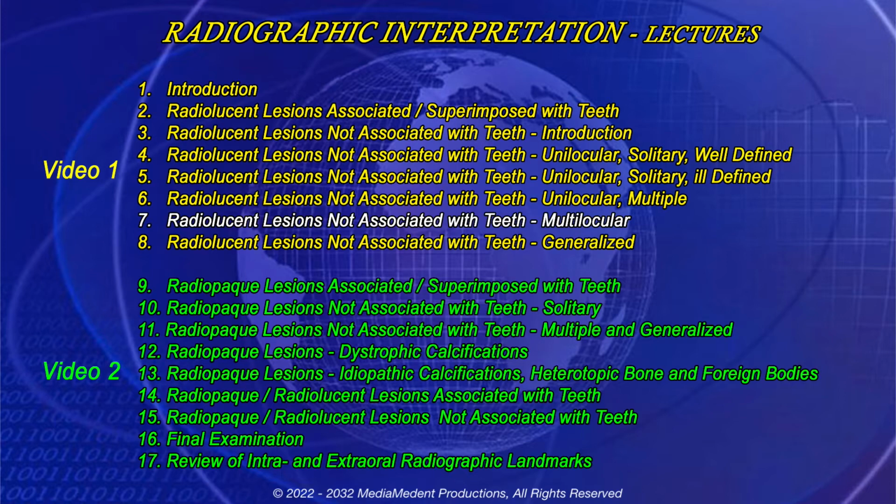Each lecture will be illustrated using cases that may be included in your differential diagnosis. Each example will include a clinical description of a patient who presented for dental care.